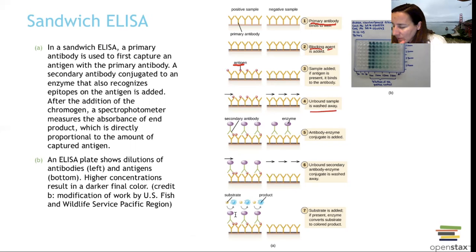Step 5, now we're going to the other slice of bread on our sandwich. Now is our secondary antibodies, and they attach on. So our antigens are sandwiched in between the first primary antibody and your second antibody. And that second antibody is going to have the enzyme complex on it. Then we're going to rinse again, because we always rinse. And now step 7, substrate.